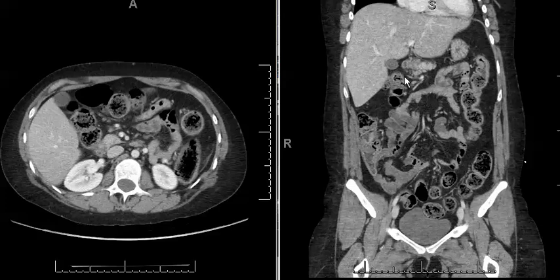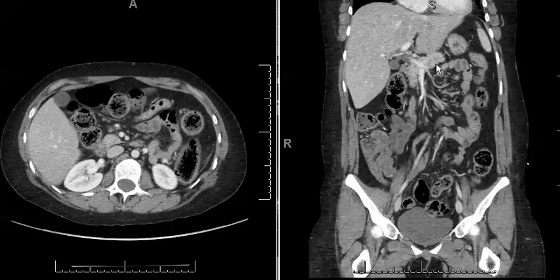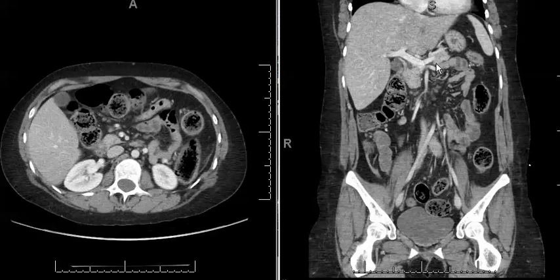Here we have axial and coronal CT images through the abdomen and pelvis after the use of intravenous contrast. This is a 22-year-old female with right lower quadrant abdominal pain to rule out appendicitis.